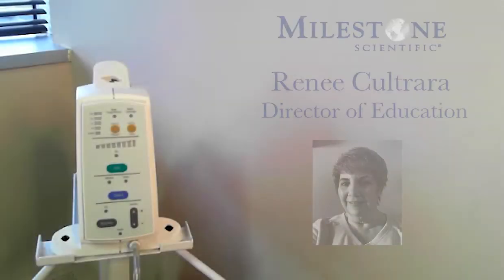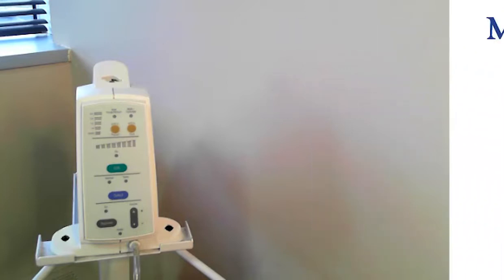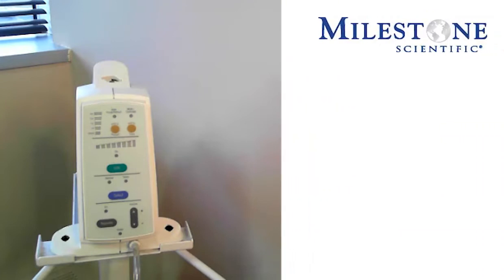Hello, my name is Renee Coltrera, and I'm a dental hygienist and the Director of Education for Milestone Scientific. I'm here today to show you how to effectively demonstrate the Single Tooth Anesthesia Delivery System.